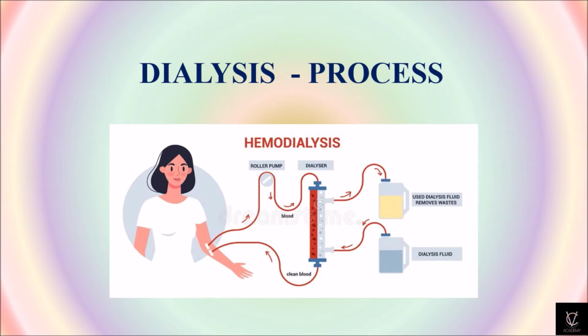In today's class, we will see what is dialysis and how the process is done. So, what is meant by dialysis? Before going into the dialysis process, we will see some important terms.